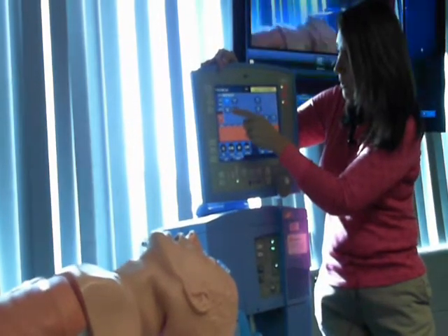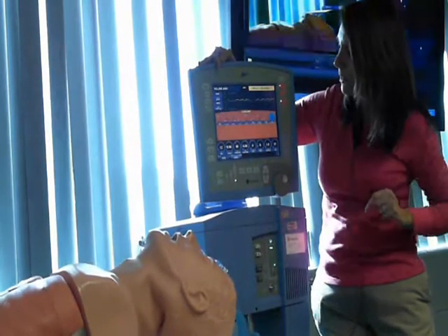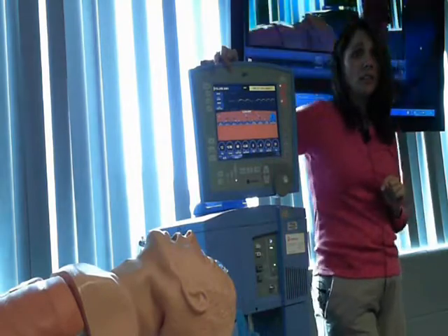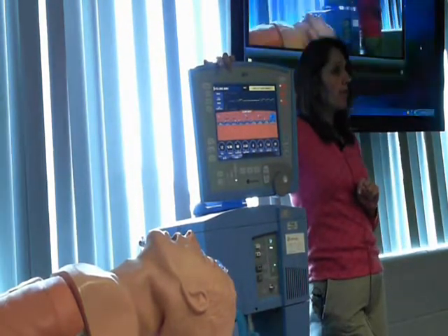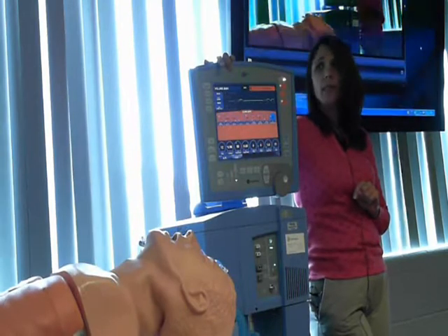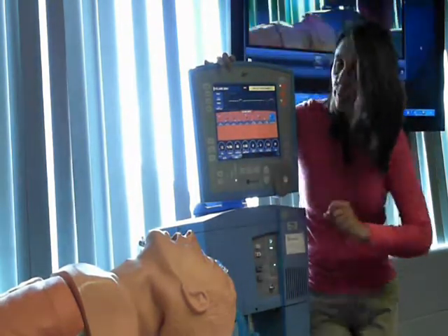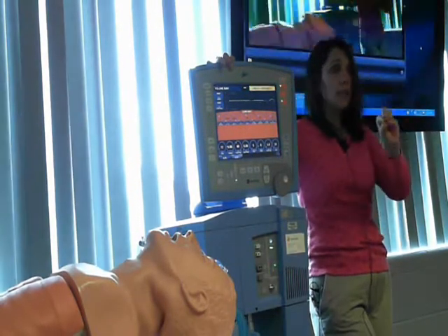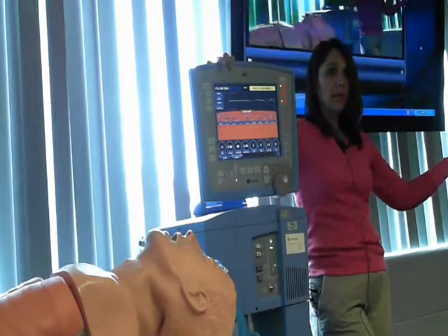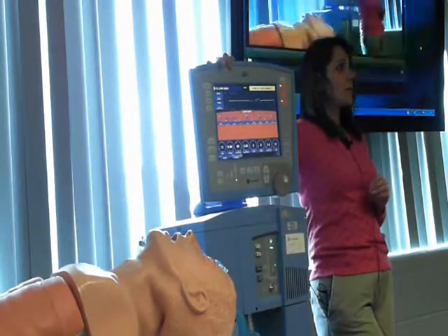Another mode that you are going to see is SIMV. So I'm going to put this person into SIMV. SIMV is synchronous, intermittent, mandatory ventilation. So what does that mean? That means right now I'm set on a respiratory rate of 12. This vent is going to deliver at least 12 breaths per minute at the prescribed tidal volume of 560.